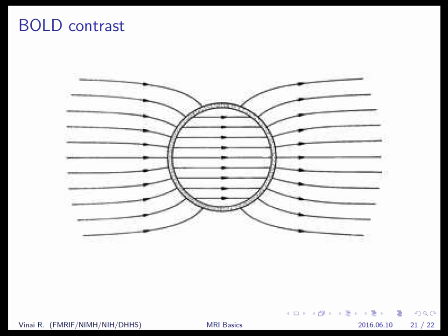But we do make pictures like that. Yeah, with long TEs. Right, yeah, to highlight. So actually, that's the whole basis of, when I talked about last week, susceptibility weighted imaging, which was pioneered or coined by Mark Haacke, in which he does exactly that. He collects long echo time or T2 star weighted scans, and it basically highlights any magnetic field inhomogeneity, so it gets at signal dropout, but it also gets at veins, and the veins show up as dark dots.